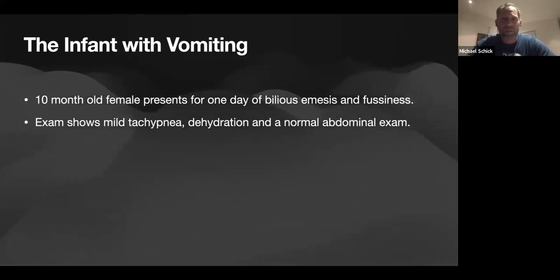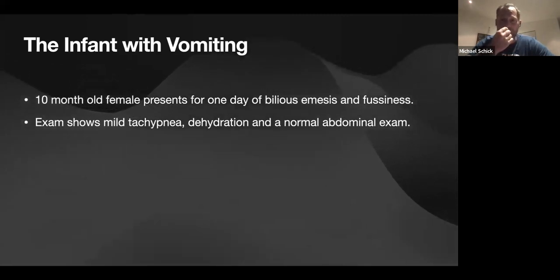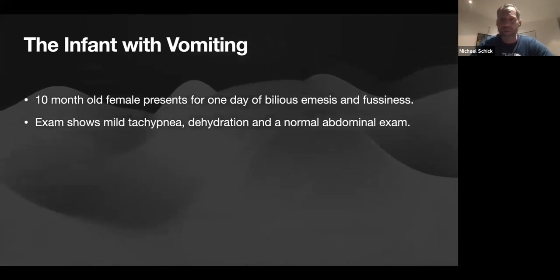The next case is the infant with vomiting. Not our first infant with vomiting. This is a 10-month-old female that presents for 1 day of bilious emesis, fussiness. Exam shows mild tachypnea, dehydration, and normal abdominal exam.